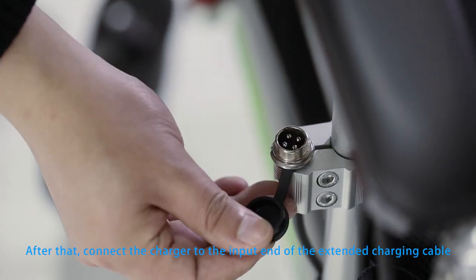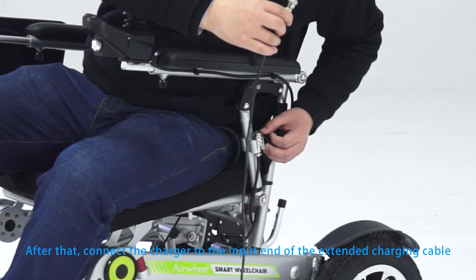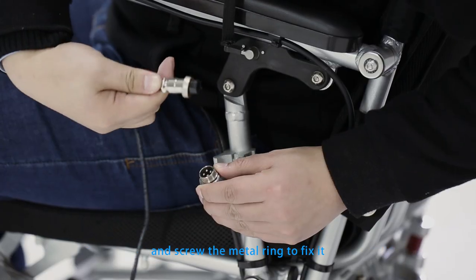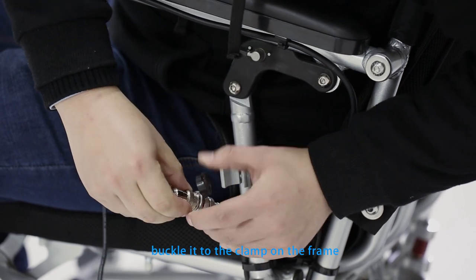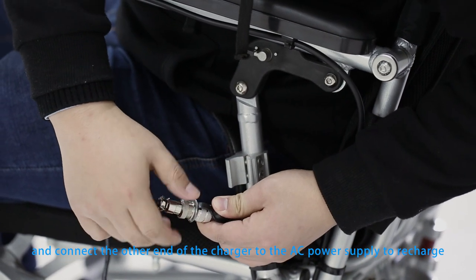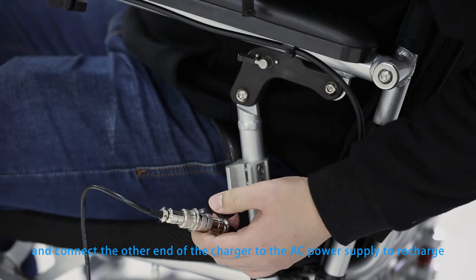After that, connect the charger to the input end of the extended charging cable and screw the metal ring to fix it. Buckle it to the clamp on the frame and connect the other end of the charger to the AC power supply to recharge.